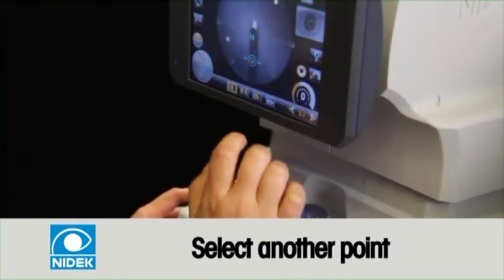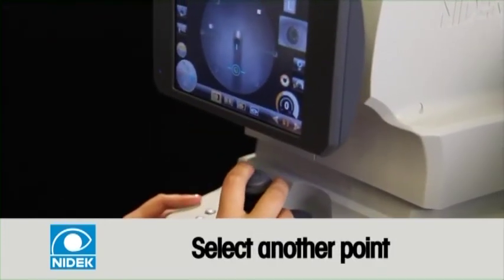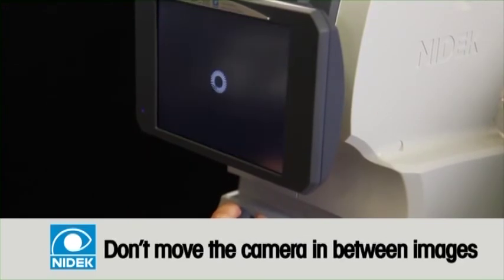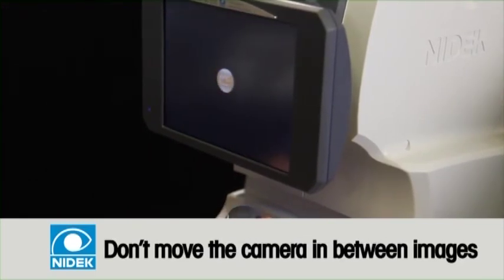If the image is accepted, select another point. Do not pull the camera back in between images. By leaving the camera in the same position, the operator is in perfect position for another image.